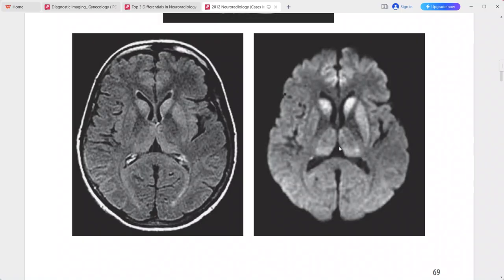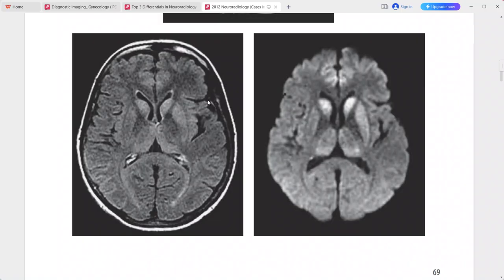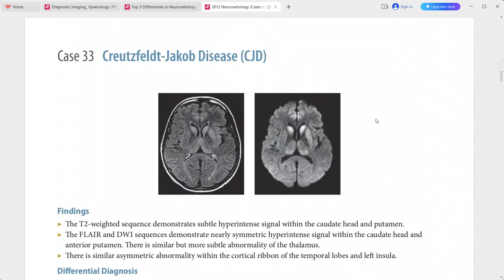There is subtle hyperintense signal in both thalami, and asymmetric abnormality within the cortical ribbon of the temporal lobes and left insula. This is a case of Creutzfeldt-Jakob disease.